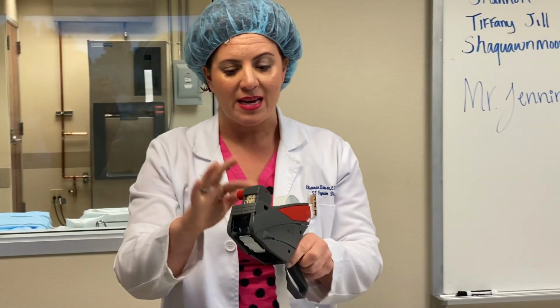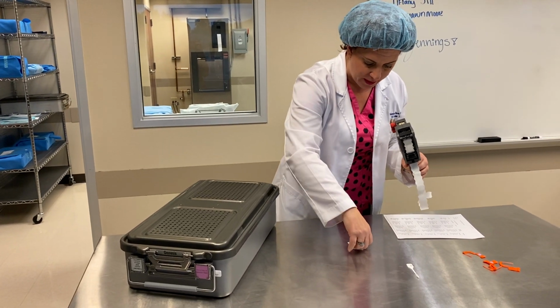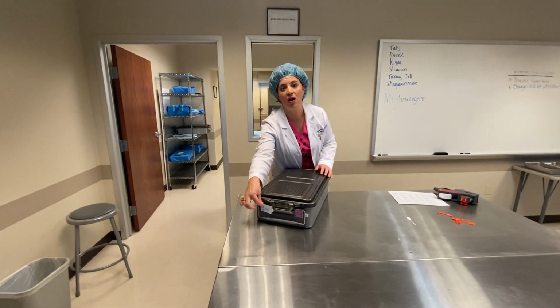So they would set that. You're just gonna put that sticker on here. Typically, the site wants you to put your initials on here as well, and then that's gonna get slipped into the slot on the tray.